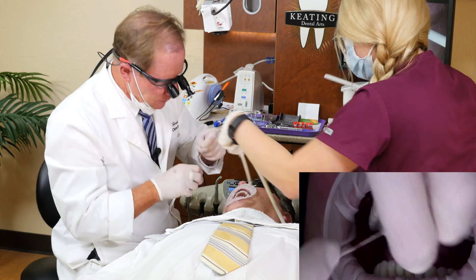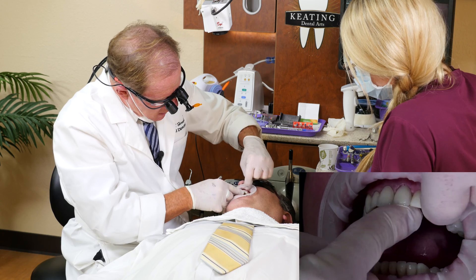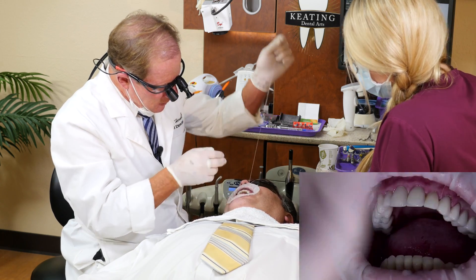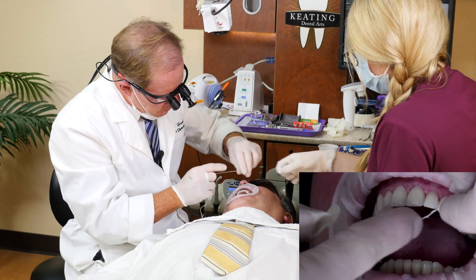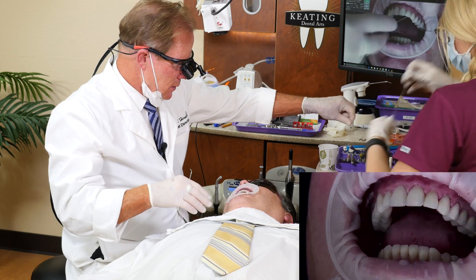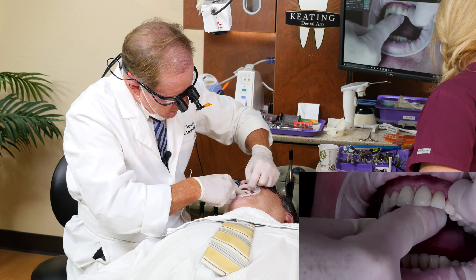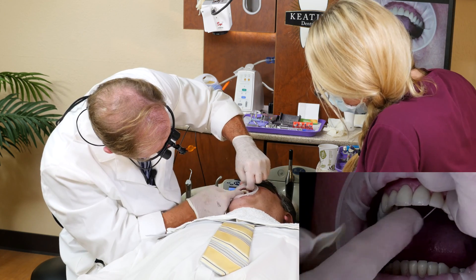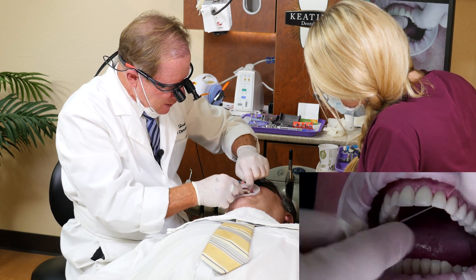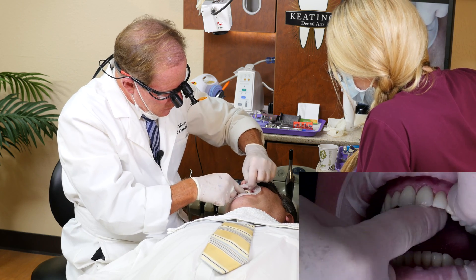Let's go ahead and rinse. Beautiful. I'm going to floss through again — contacts are great, margins are great. Just a little bit of excess cement there. Perfect.